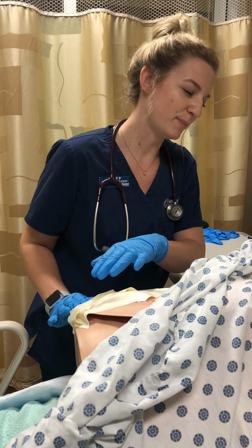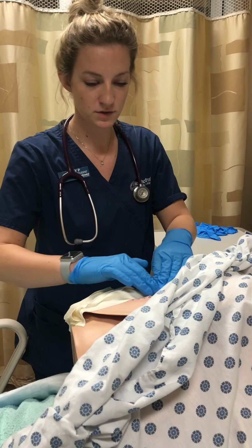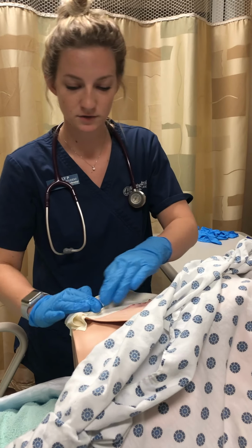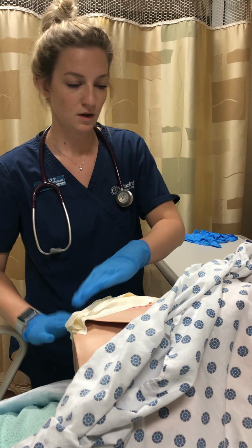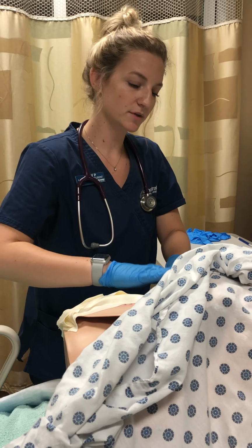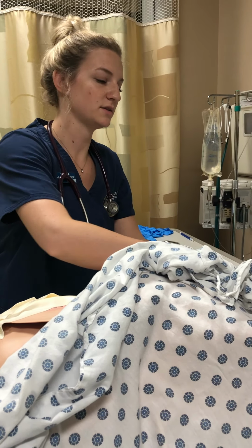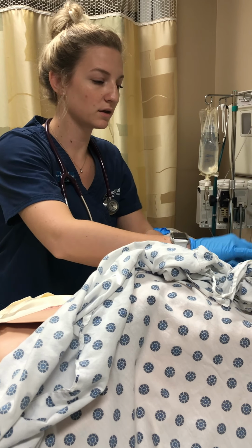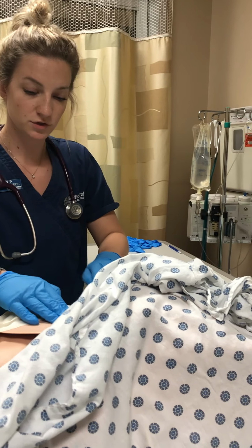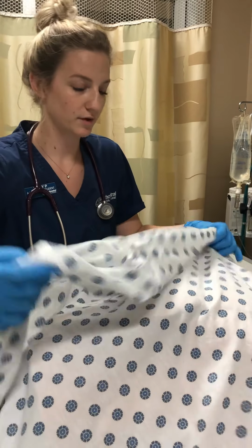So everything looks good. All right, I'm just gonna go ahead and press around here a little bit. Let me know if you're having any pain, okay? So I'm just gonna palpate around here. Do you have any pain at all? He says no. All right, I'm just gonna check up here too, looking for any crepitus or any subcutaneous emphysema up around his neck. I don't feel anything, which is good. All right, and then while I'm doing that, I'll cover you back up here.